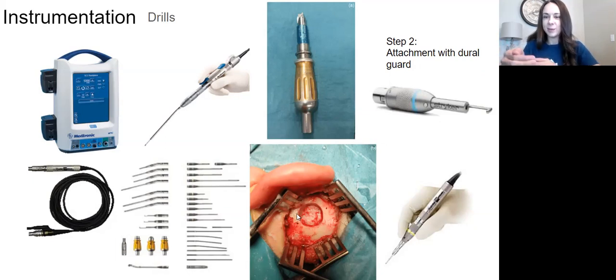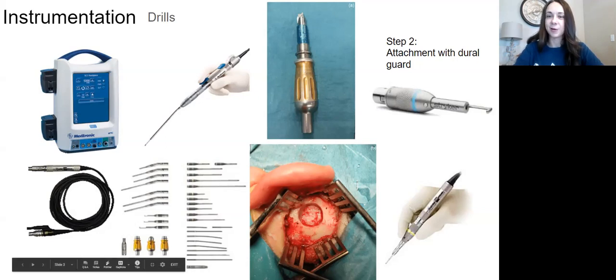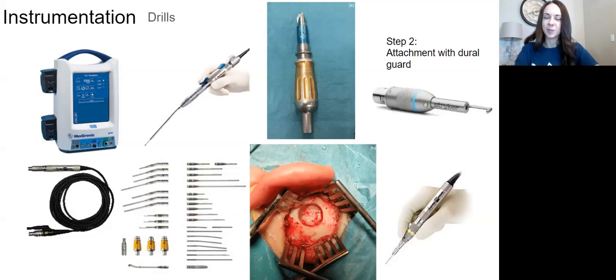Now it's got that nice piece of metal protecting the dura, so they can drill all the way around without ripping the dura, because sometimes your dura likes to stick to the bone. So when they go to start drilling, it could start ripping it. You don't want to rip the dura. We want to very nicely and precisely cut it just right so that we can sew it back together properly. So you don't want to rip the dura. So step one, we're going to make a burr hole. Step two, I wrote out for you. You're going to use the dural guard to drill all the way around and take that bone flap off.